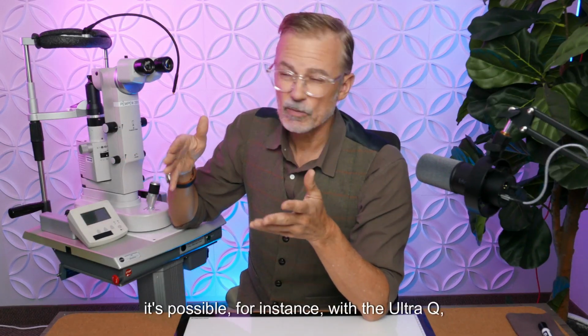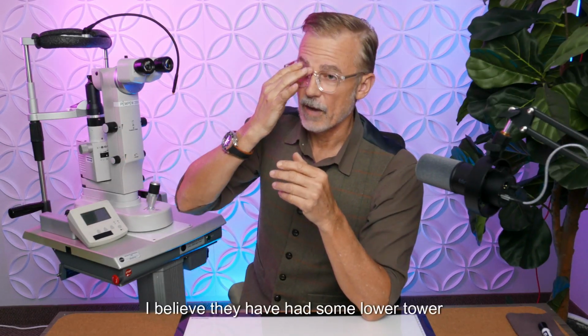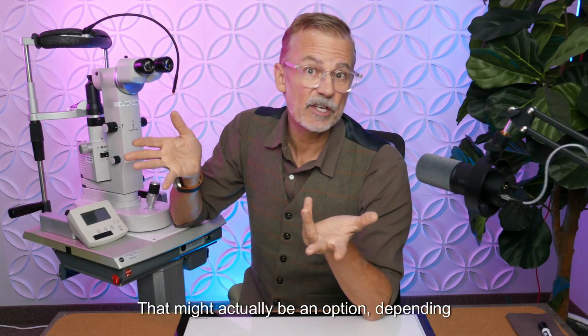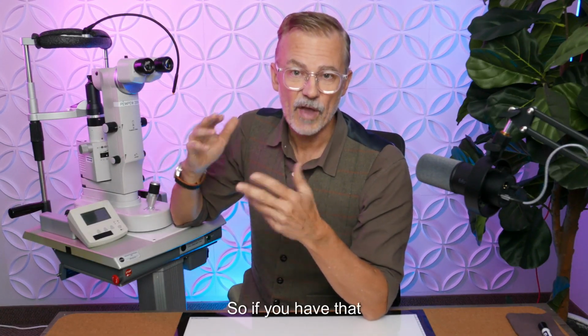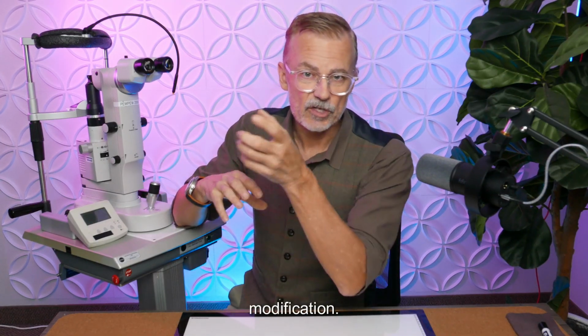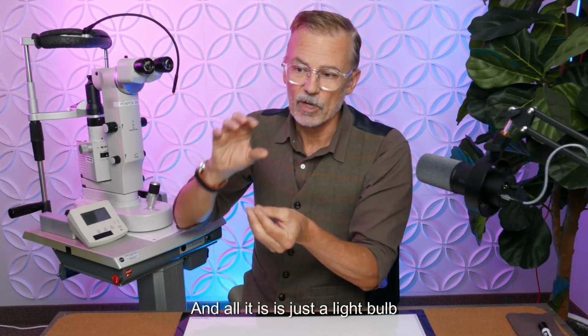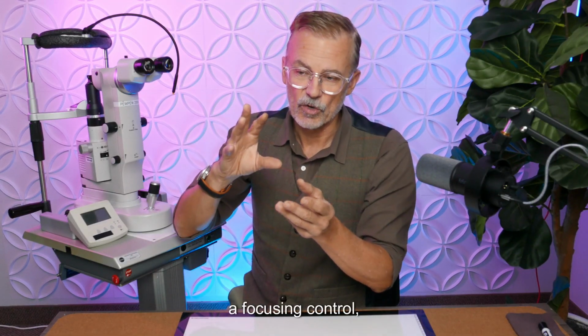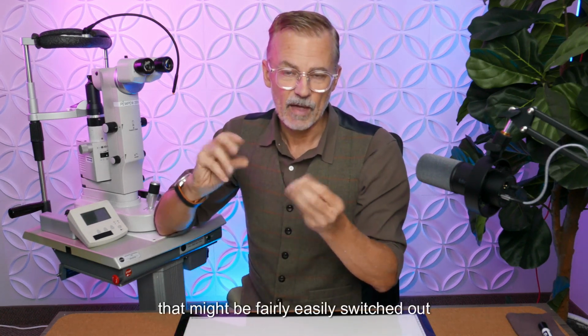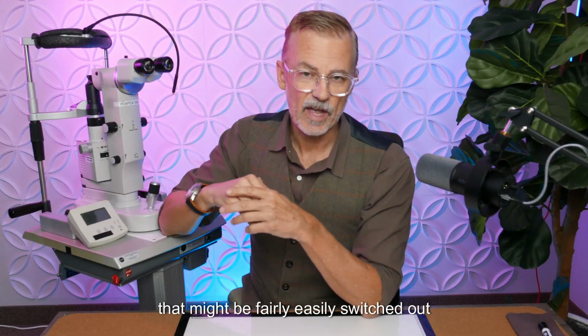Now, it's possible, for instance, with the Ultra Q, I believe they have had some lower tower models, and so it might be possible for the manufacturer to switch that out. That might actually be an option depending on your preference. So if you have that lower tower, you may not need to replace the entire laser. You might be able to just get a modification, and all it is just a light bulb and a focusing control, a narrowing control, and a mirror. So that might be something that might be fairly easily switched out without having to change the laser at all.